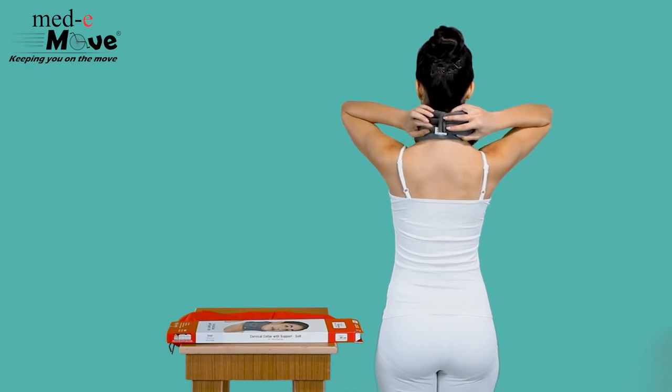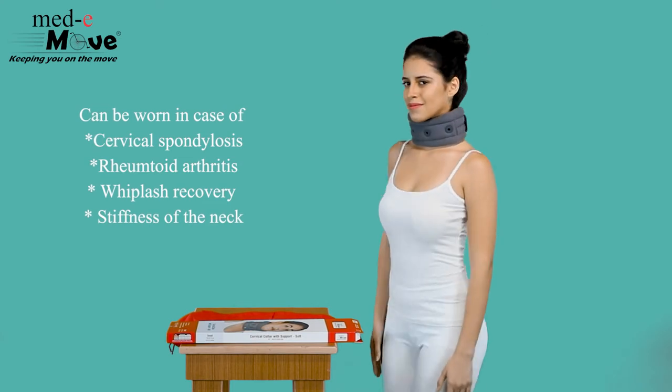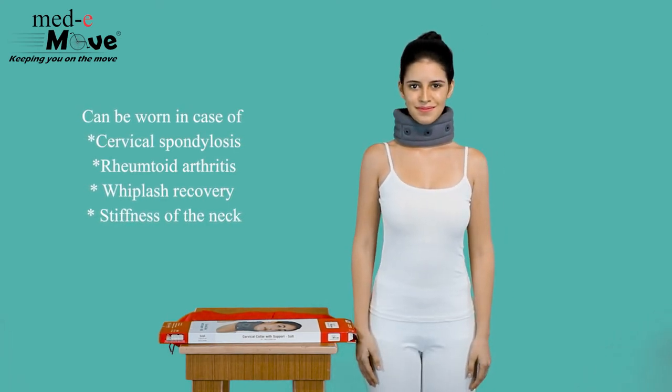The Medimove cervical collar soft with support can be worn in case of cervical spondylosis, rheumatoid arthritis, whiplash recovery, and stiffness of the neck.